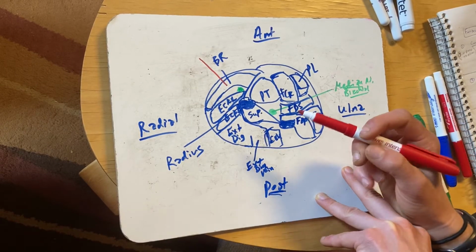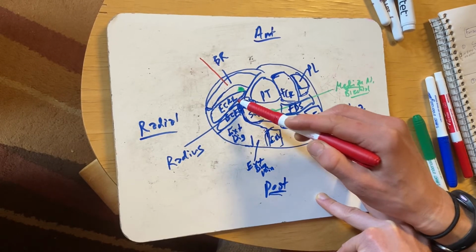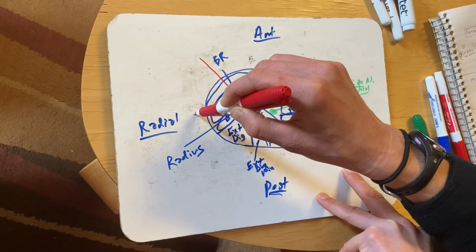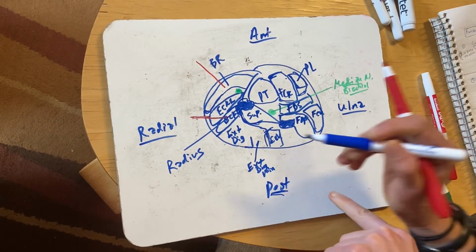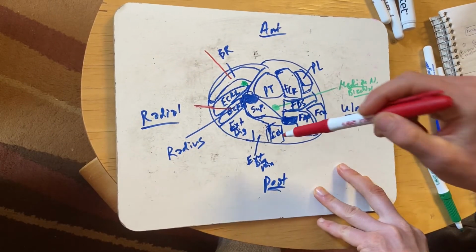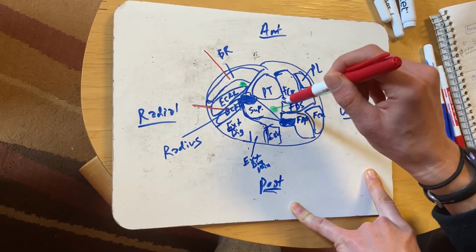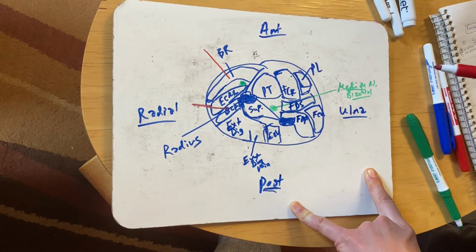The other thing I want to think about is needling ECRL, ECRB, so extensor carpi radialis longus and brevis, and I can angle those again towards the radius, but stay more superficial to get those muscle groups. Extensor digitorum is going to be a little bit more posterior, and again, I'm going to think about angling towards the radius. If we think about this Christmas tree direction, I want to angle either towards the radius or towards the ulna to avoid going deep and coming into this neurovascular bundle or sensitive bundle of structures that we mentioned in the cross section.